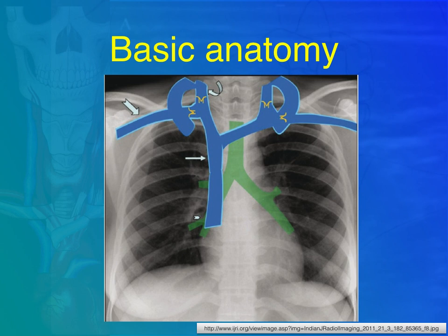Sometimes you can feel mild resistance when cannulating the IJ and subclavian, and this is because of the presence of valves in both veins. So just be mindful of this, advance the wire carefully, and changing the position of the wire may overcome this, as long as you know you are inside the vessel. And how do you know? With your ultrasound.